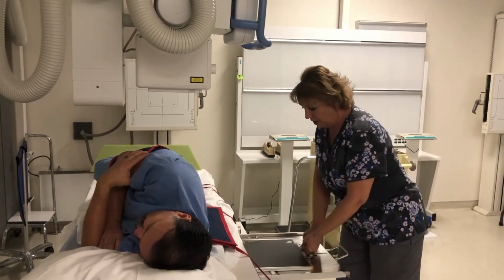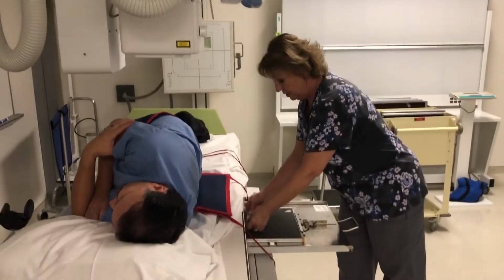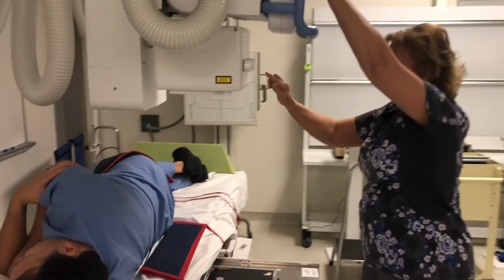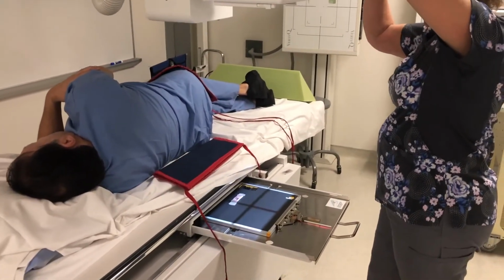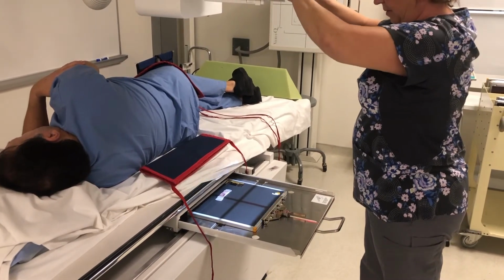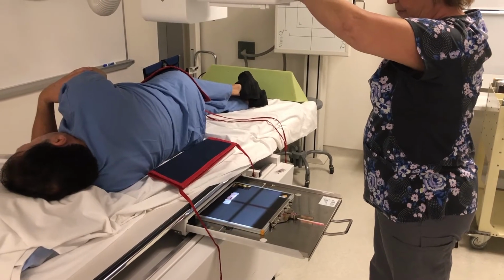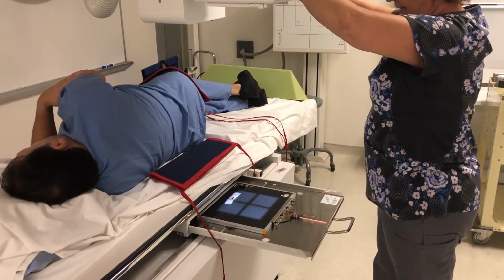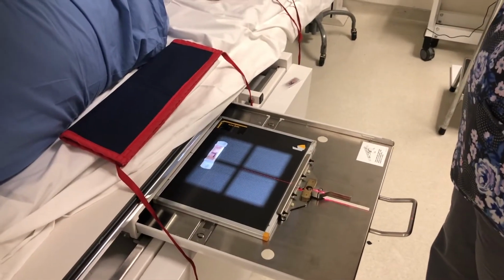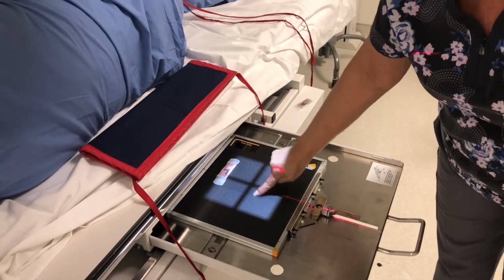So I've got a smaller IR in here, and patient's on his left side, so I'm using a left marker. And then this collimation is quite small. It can be 5 by 5, 6 by 6, something like that. I'm coming down from 8, let's say, to a little less than 6, and from 10 to a little less than 6. So it's pretty much a square 5 by 5, 6 by 6 collimation, because I'm just looking at L5 and S1.